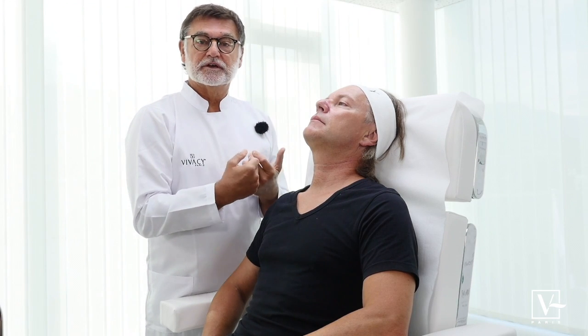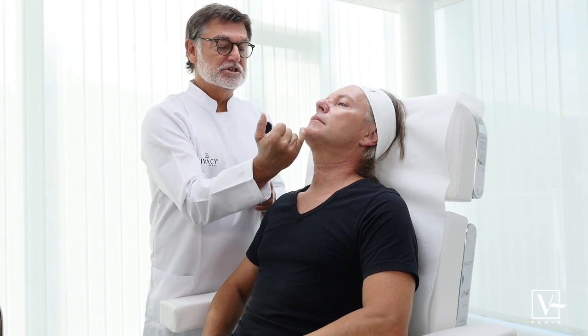I suggest to Dan that the chin also — it is a bit protruded — so we're going to use Stylage XL on the chin with one injection point, and also to define his jawline, to make it more obvious and more masculine, by injecting on the gonion, on the angle of the mandible.